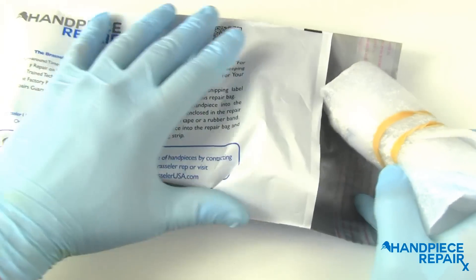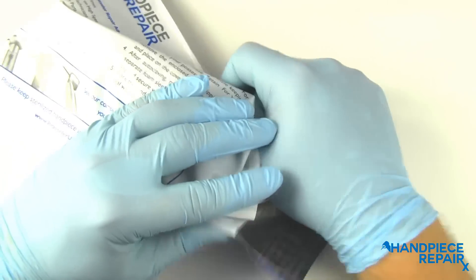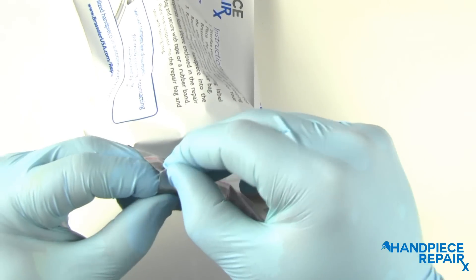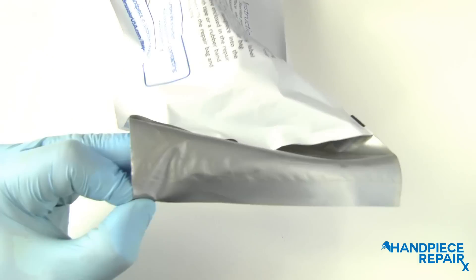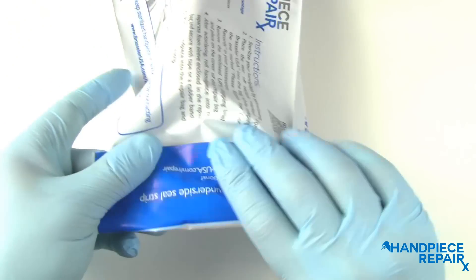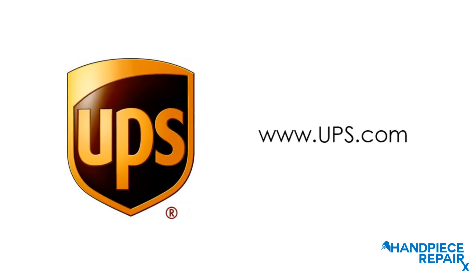The next step is to place the hand piece in the bag. The outer flap has a liner that can be removed to expose the adhesive underneath, and seal the bag.